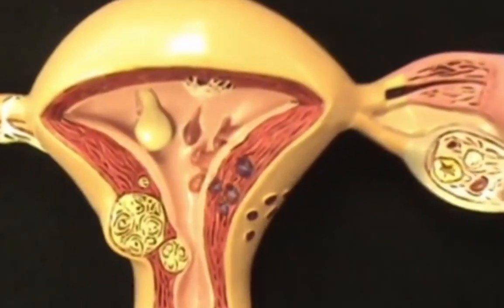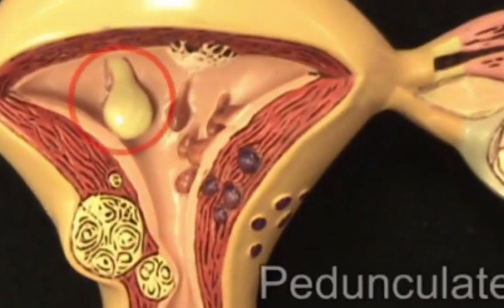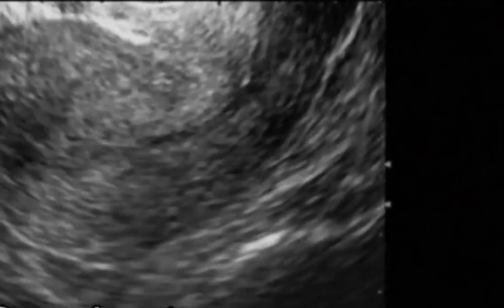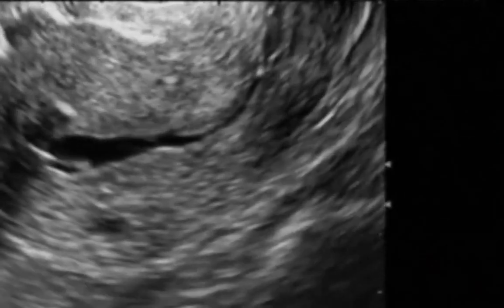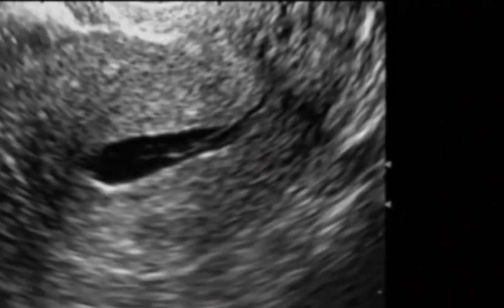distorted by congenital malformations, fibroids, polyps, precancerous and cancerous masses. Sonohysterography is one method to evaluate the uterine cavity. It is particularly helpful in the context of infertility or abnormal bleeding. During a vaginal ultrasound scan, sterile saline is injected into the uterine cavity, distending it. Because water transmits sound so well, intracavitary masses are easy to identify and the uterine lining can be easily evaluated.